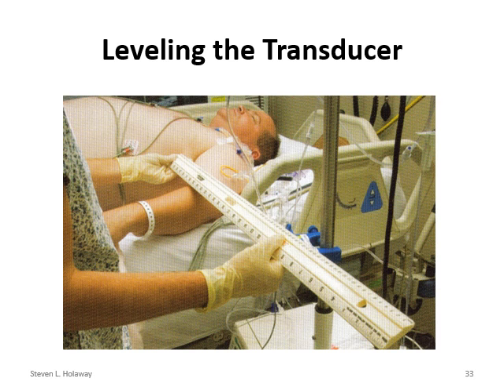Showing here basically doing that. To level, you just take some type of ruler or rod that has a bubble level in it, and you basically will level to the top of your transducers. Your facility will have specific guidelines of which part of the transducer to level to. It may be the bottom, it may be the stopcocks. It doesn't matter. Follow your standard operating procedures and level to where they tell you to level. And then maintain that always.